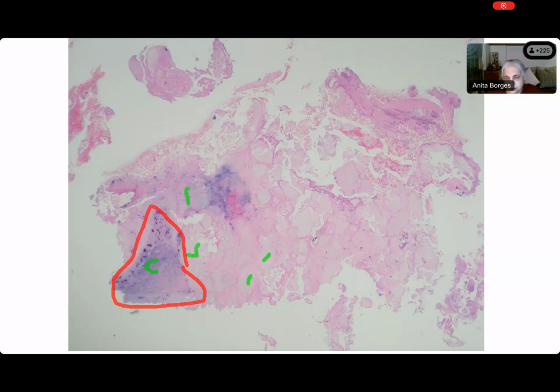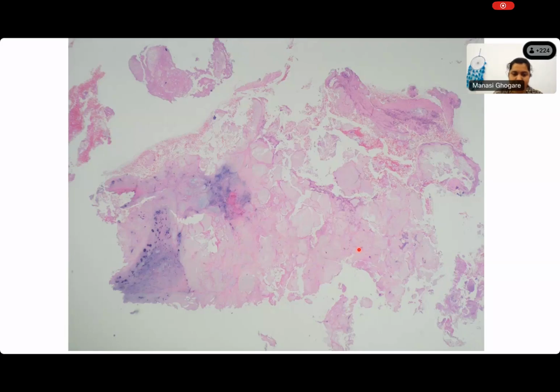What are we seeing? This looks like sclerosed. It looks sclerosed to you. Mansi, before we start interpreting something as being sclerosis, we have to describe it. Please describe what you're seeing. You were right when you said that you did not see cells. It is extremely hypocellular, almost acellular. What you see is one big acellular fragment, a piece of tissue.